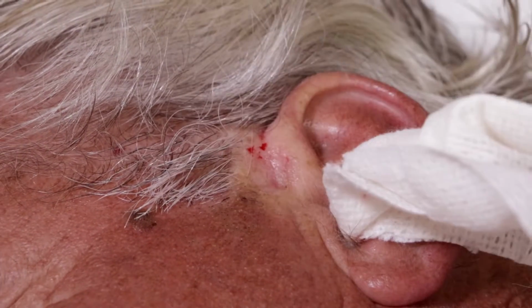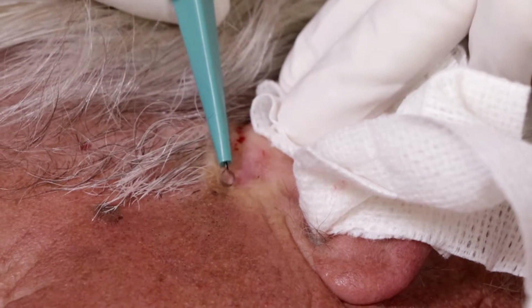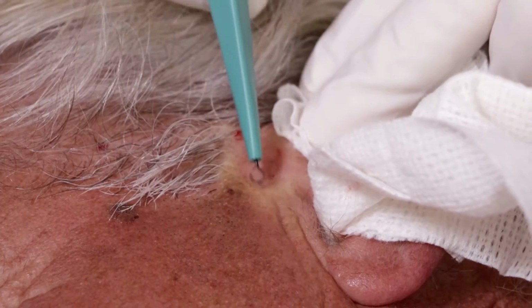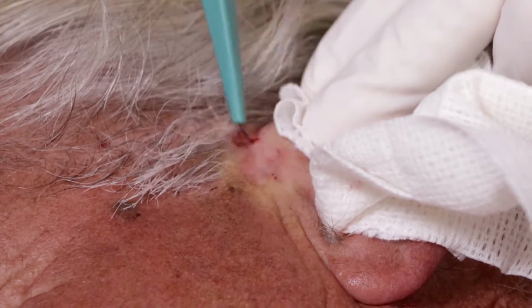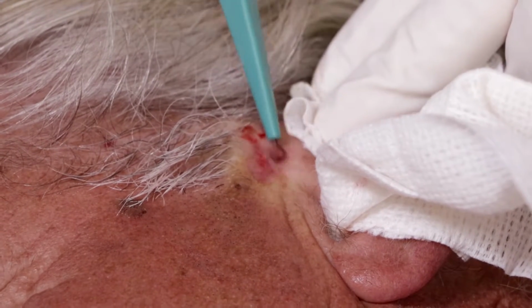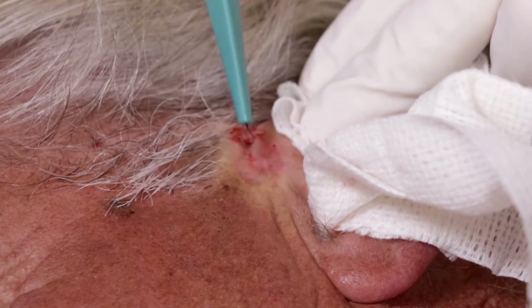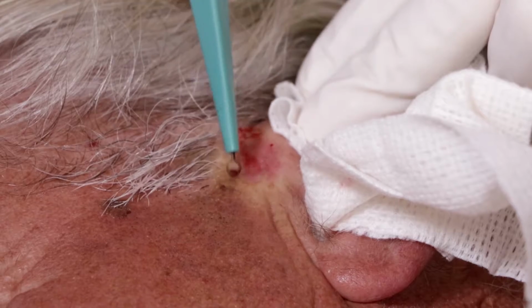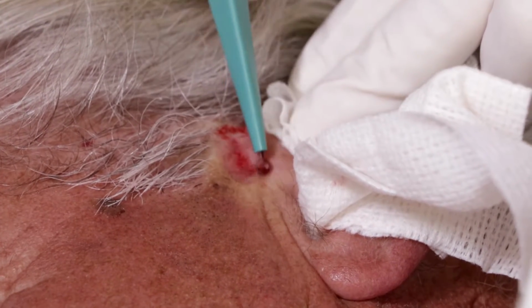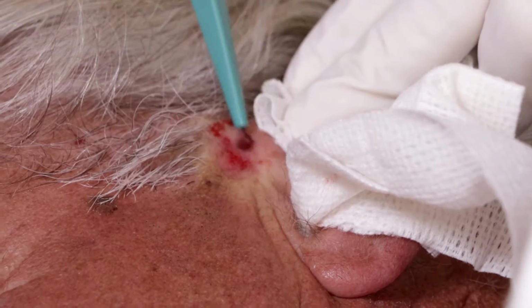Epinephrine's helping to limit the bleeding. Here we go. Curettage. So it's a scraping. And normal skin doesn't come off. That's amazing. But there is a feeling that the operator can feel, that being me, when it's going over the cancerous tissue. You can feel it coming off. So I'm going all the way to the edges.